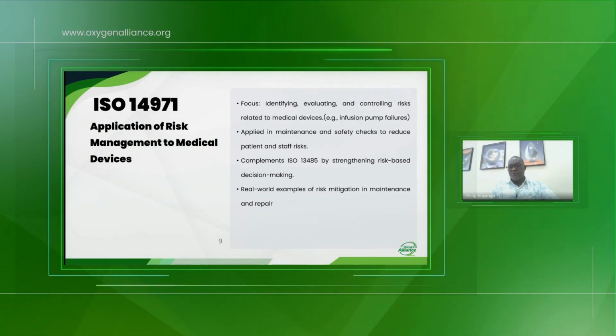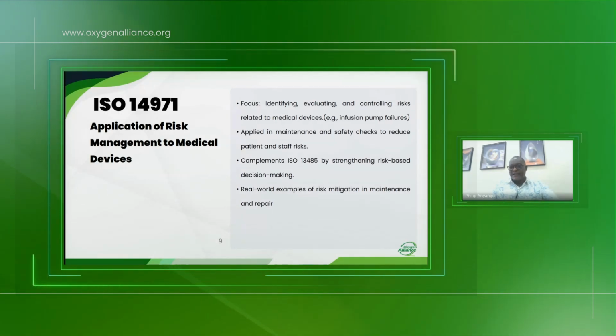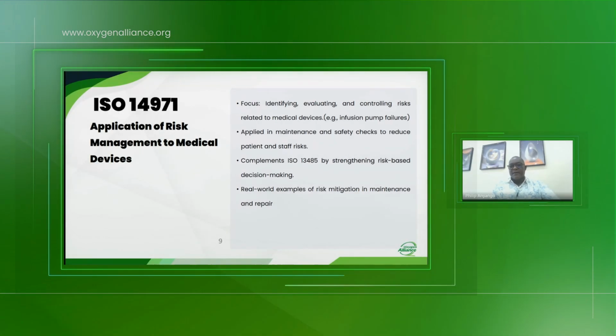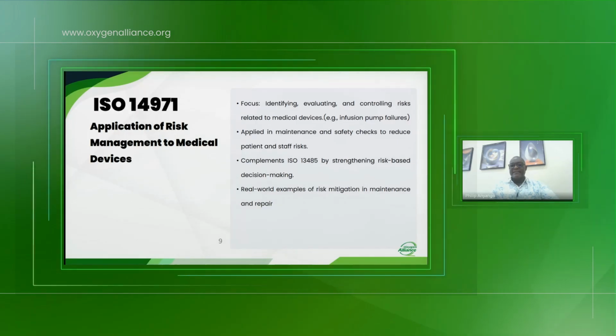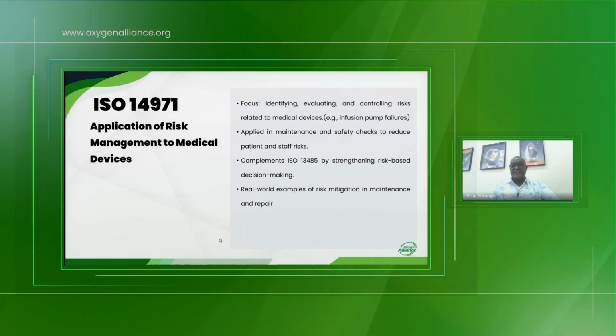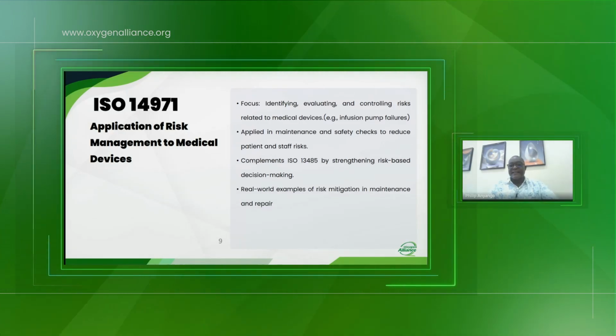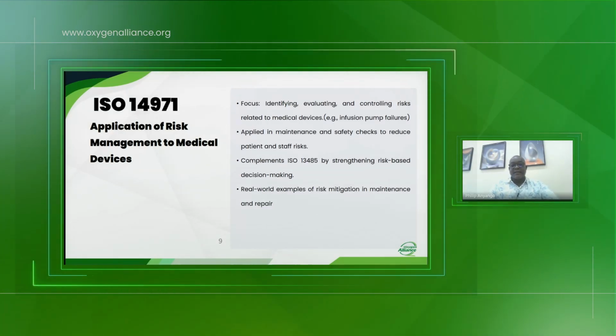And as you know, medical devices are those equipment that are directly used on the patient. It is applied in maintenance and safety checks to reduce patient and staff risks. It complements ISO 13485 by strengthening risk-based decision-making.